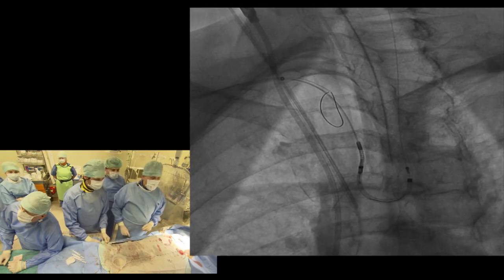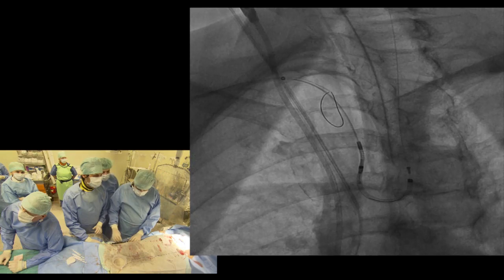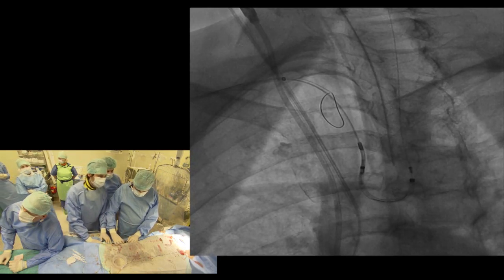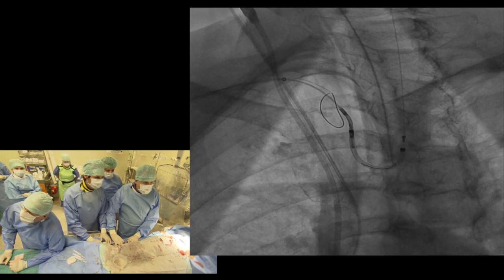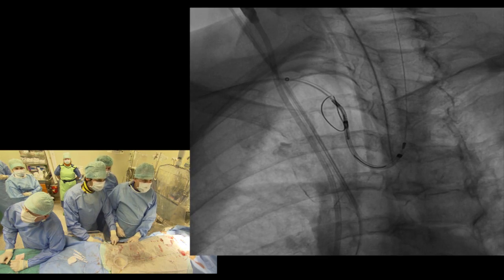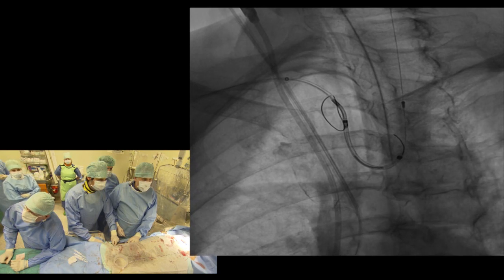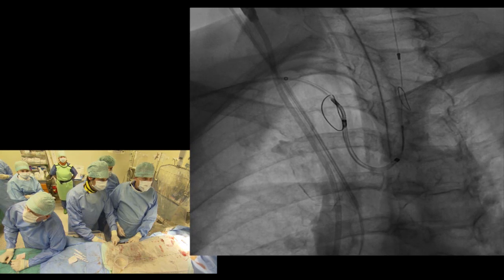Let's, if we move the whole blue part as on top as possible, but we have to keep the filter still and just pull a part of the blue part, right? Yeah, to get it in. Exactly. Now it is okay. That's enough. I think it is enough. Now we can deploy the filter. Deploy the filter. Keep going. I think it is very nice.